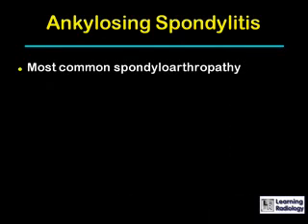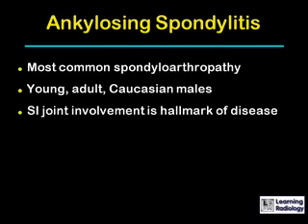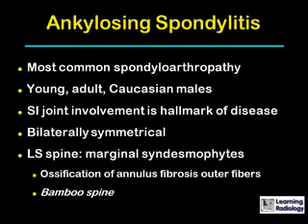Ankylosing spondylitis is the most common spondyloarthropathy. It usually occurs in young adult Caucasian males. The sacroiliac joints are invariably involved and are the hallmark of the disease. The fusion is usually bilaterally symmetrical. In the lumbar spine, we see marginal syndesmophytes — ossification of the outer fibers of the annulus fibrosis — producing the so-called bamboo spine.